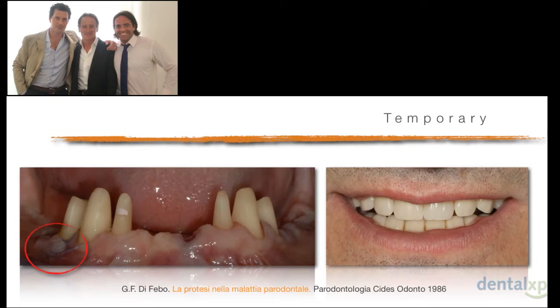And you can see here there is no swelling, because we see that using the conscious sedation approach, also the follow-up of the surgery is less traumatic for them. So again, another small detail that can help the quality of life of our patient in the middle of the treatment plan. And from there, this is our start point for our final restoration. From there, we're gonna start to evaluate everything that we can make better, everything that we should change, and from there we can start doing really our final prosthodontic project.